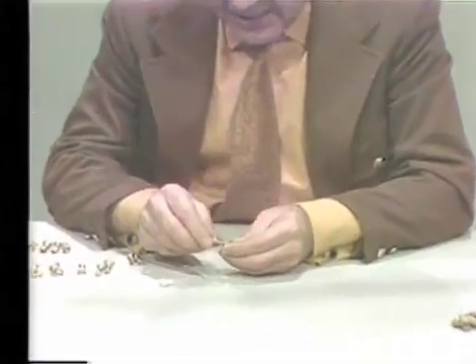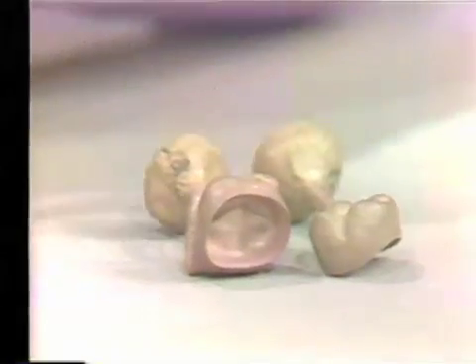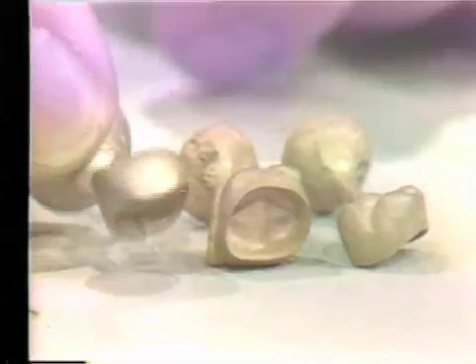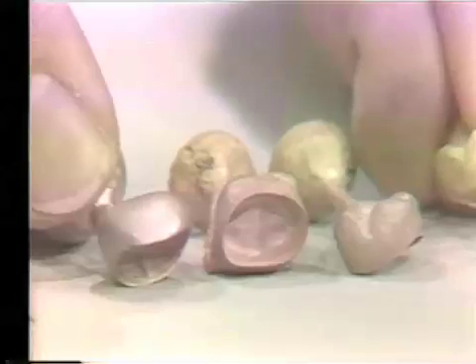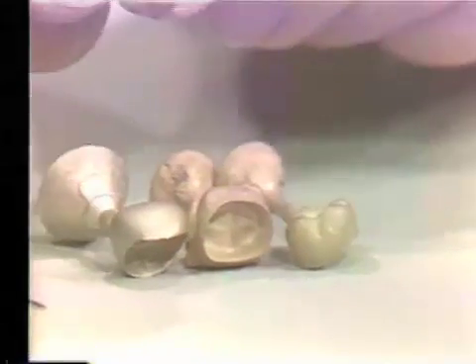Here are some full crown castings. These are the high heat technique — 1,200 degrees has been used — and you can see the surfaces are not very good. Here, by contrast, is a 900-degree burnout next to the 1,200-degree burnout. The 900-degree casting has a much better surface. This one uses the water-added technique, and once again the surface is similar in quality.